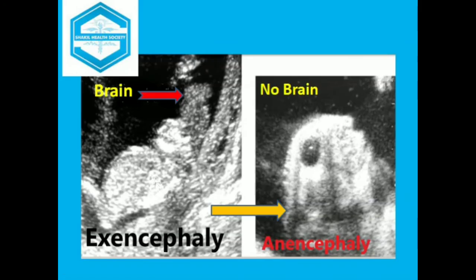This image is labelled as exencephaly, as brain tissue is present while the vault is absent. After some time, the brain will be dissolved and disappear, and it will then be labelled as anencephaly — vault absent and brain also absent.